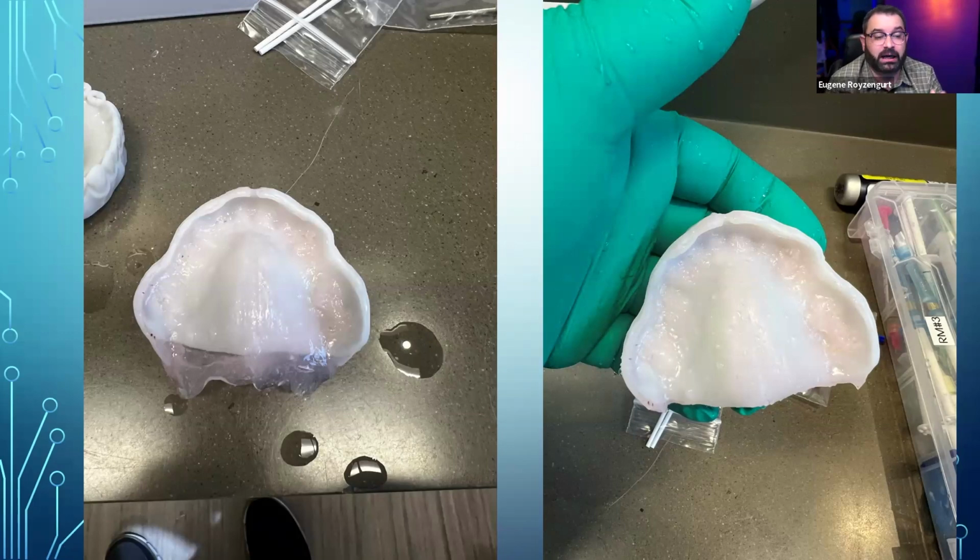And once you're healed up, we're going to use that to build you a whole new denture, okay? And from there, we can do a printed try-in. A lot of times, guys, I'll do a printed try-in, especially for patients where I'm not sure about the occlusion, for example. A lot of people will have an elusive occlusion. They don't have a stable bite. They'll bite here one time, they'll bite there one time.